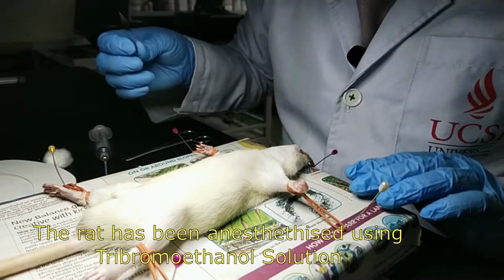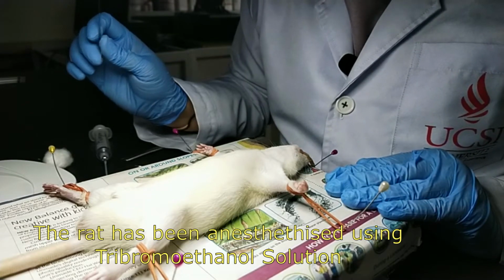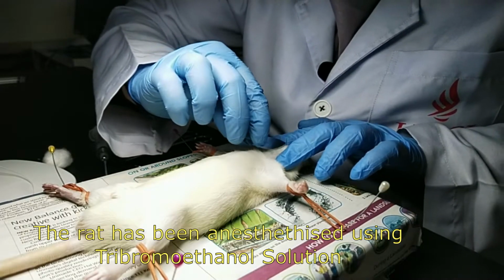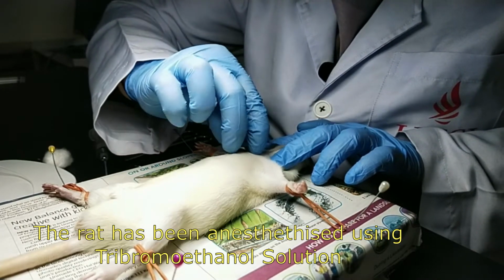For animal preparation, we are going to start off with tracheal cannulation. I'm going to make a small incision at the neck area here.